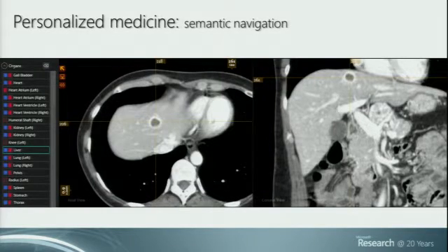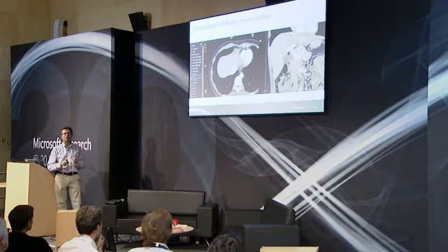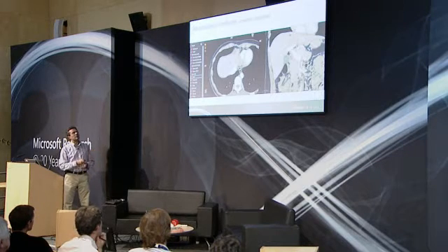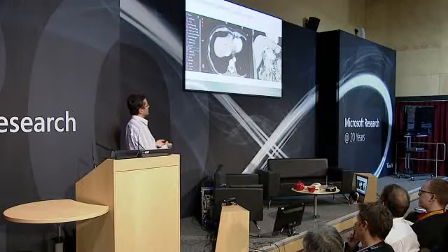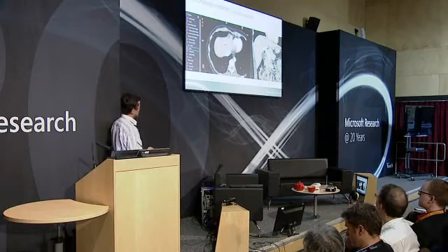Right now that I know where the liver is, I don't need to download the entire patient image from what is called a PACS database, the PACS server. I can just crop that section of the image. I can transfer it very efficiently over a limited bandwidth network, and I can now inspect the liver. And now I notice this little bubble, which is the hemangioma in the patient. So you can see how these sort of techniques can help enhance the efficiency of image navigation and browsing. And they can be useful both for experienced doctors and for non-experienced people, like the patients themselves.